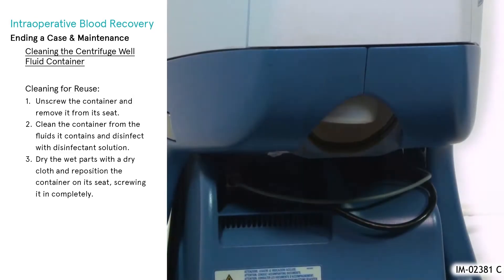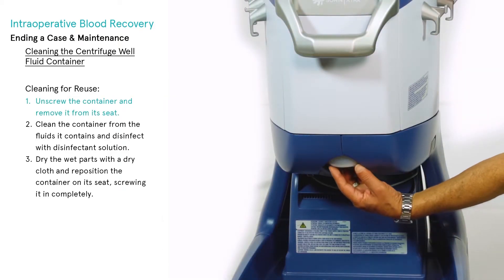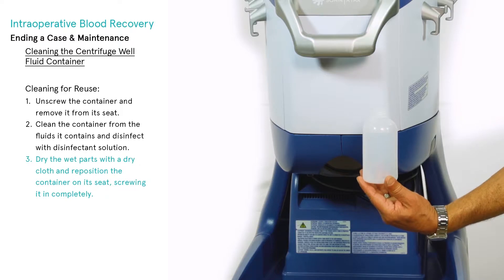Cleaning the centrifuge well fluid container: whenever organic fluids enter the centrifuge well fluid container, the container must be cleaned with suitable disinfectant solution or replaced. To reuse the container, clean as follows: unscrew the container and remove it from its seat. Clean the container from the fluids it contains and disinfect with disinfectant solution.